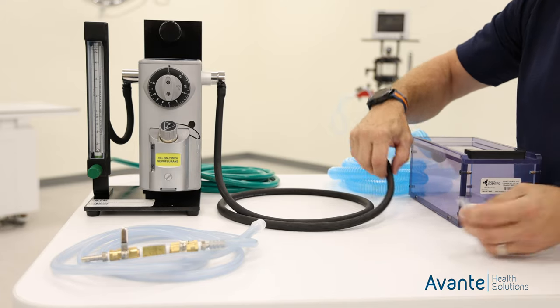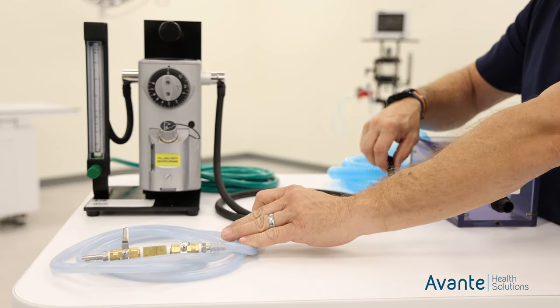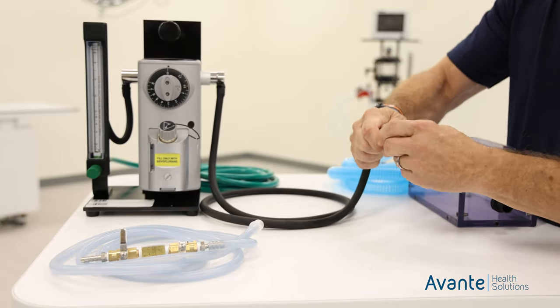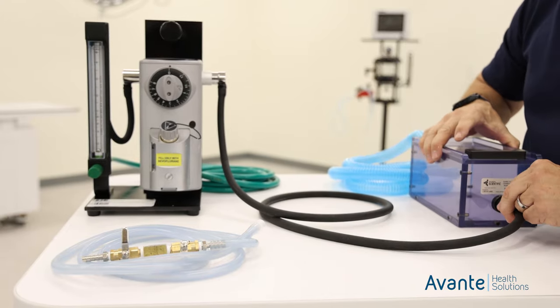If you are not splitting it, you'll take one of the adapters that came with the blue hose, place it in your neoprene hose, and go direct to your induction chamber.